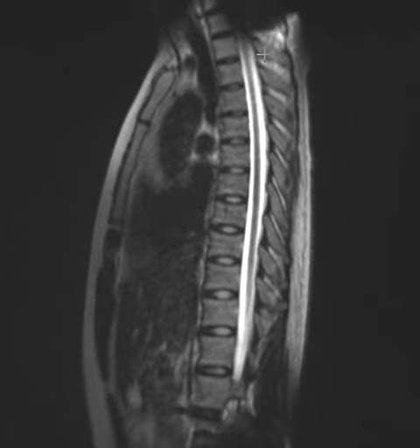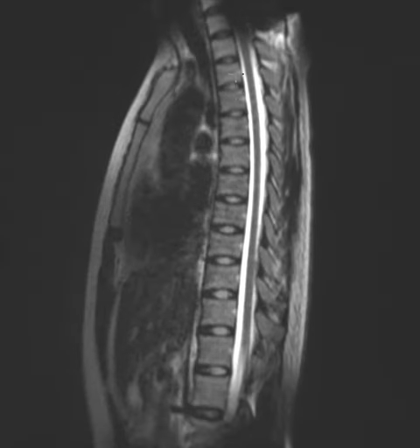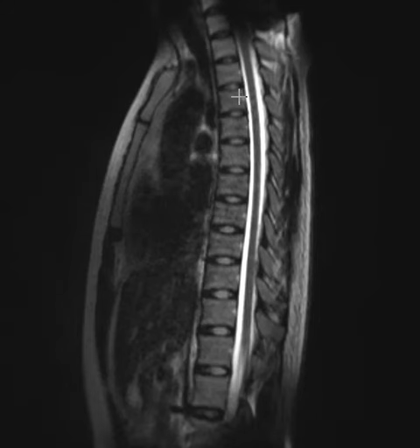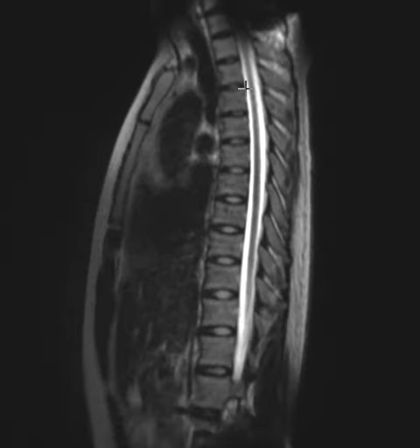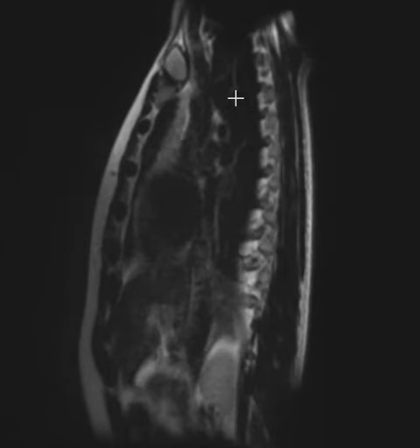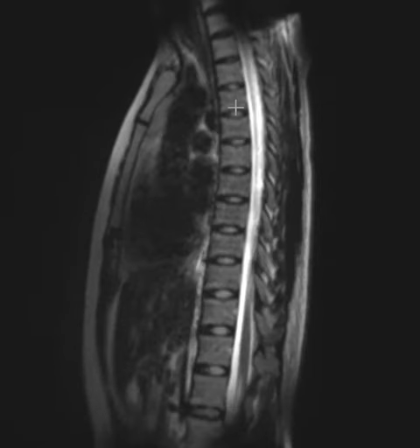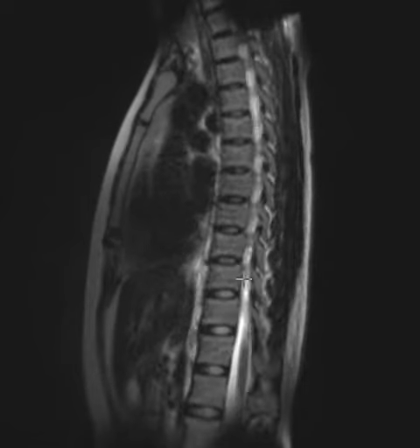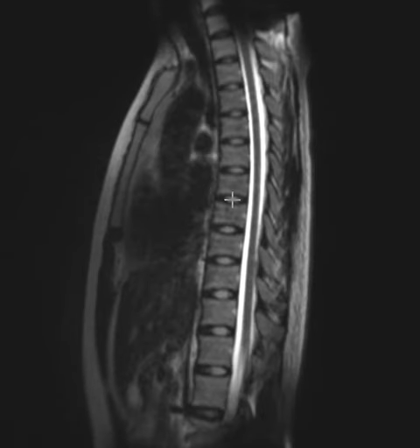She'd had severe onset of back pain, could barely move and came in just to make sure she did not have a disc herniation. Her spine looked nice and normal, so we believe she just had some muscle spasms. She's going to a doctor to get some treatment for that, knowing that she does not have any herniated disc or compression deformity or any other findings.